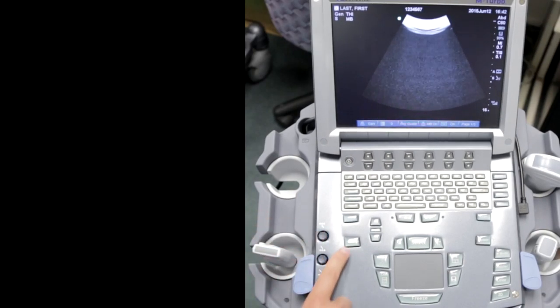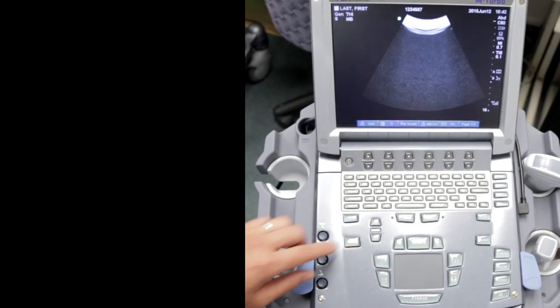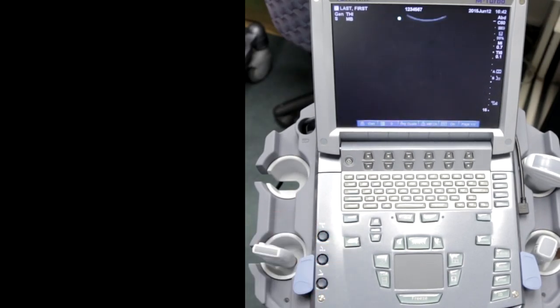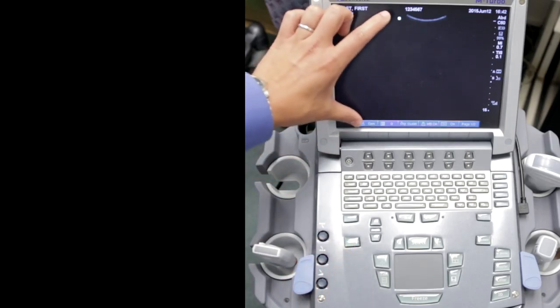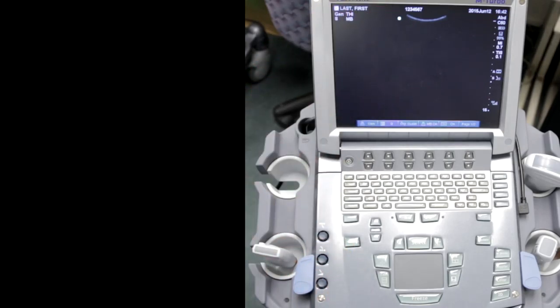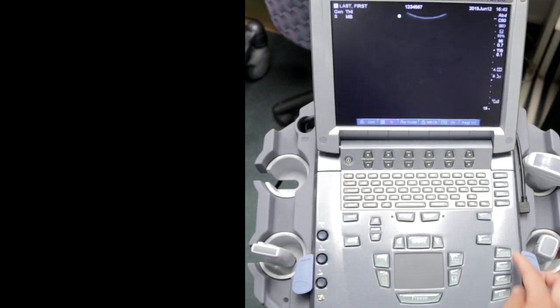There's another function called auto gain that the Sonosight has. What I would do is when I first start scanning, push auto gain, and then from there you can start changing the gain based on where it starts.